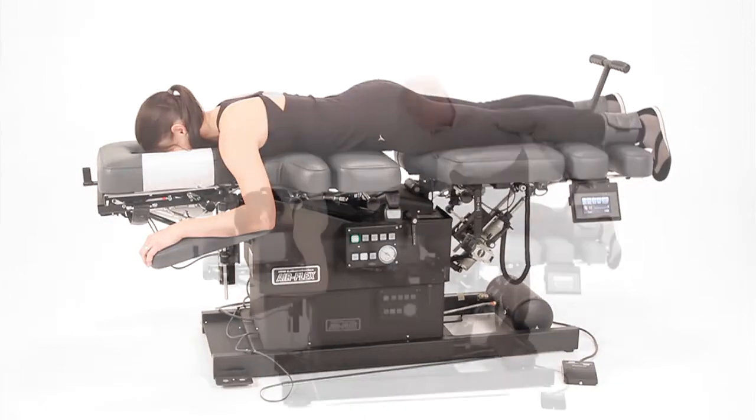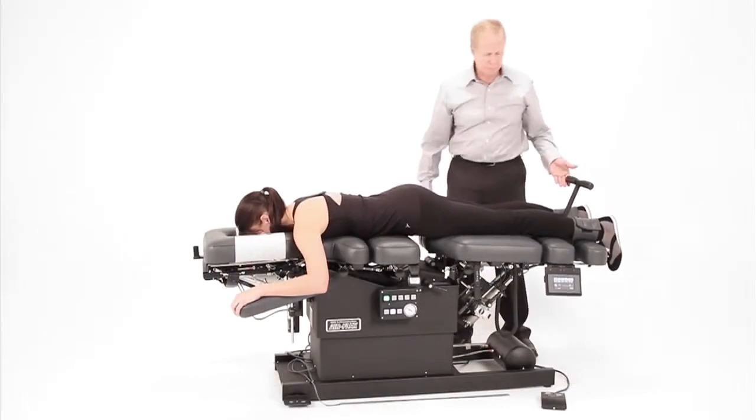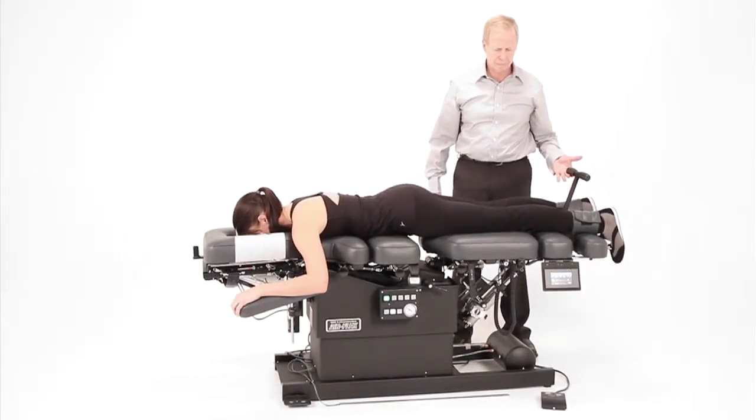You may insert the tiller bar and perform circumduction with the tips of your fingers without pushing down or bending over.